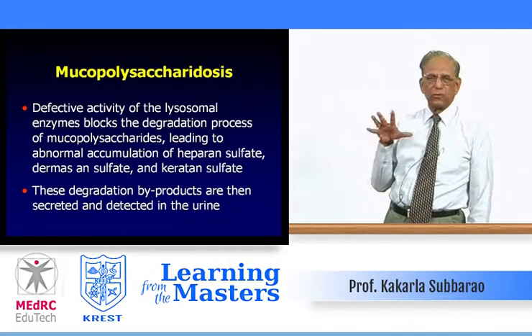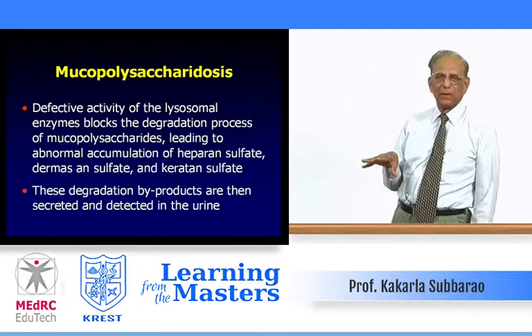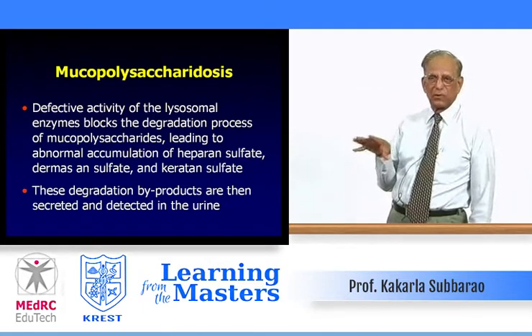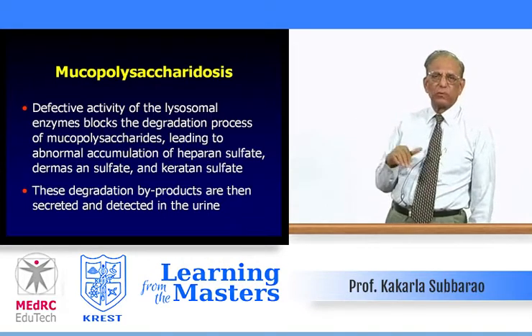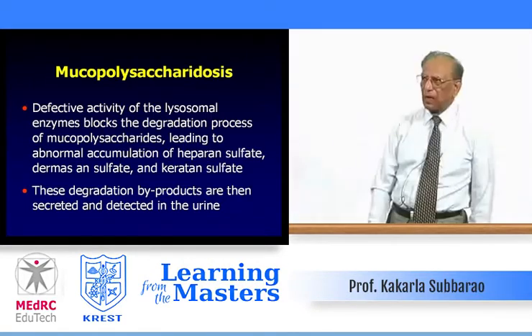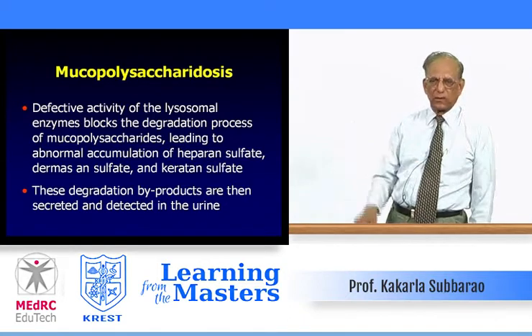Mucopolysaccharidosis, I don't want to dwell into it because it's a long, complicated, and confusing process. Because many times there is superimposition of one over the other. Ultimately, laboratory analysis of the mucopolysaccharides in the urine gives the diagnosis, with correlation with radiological findings.